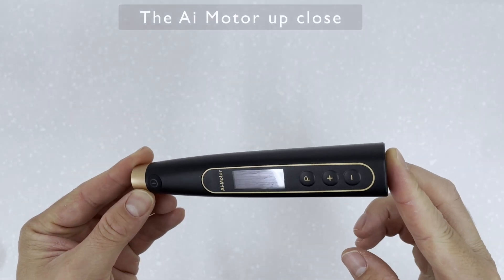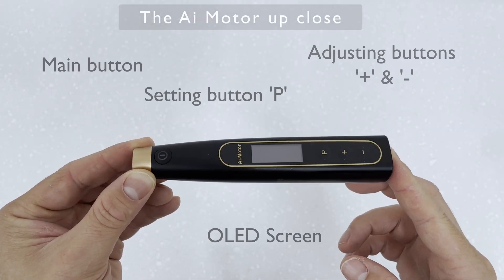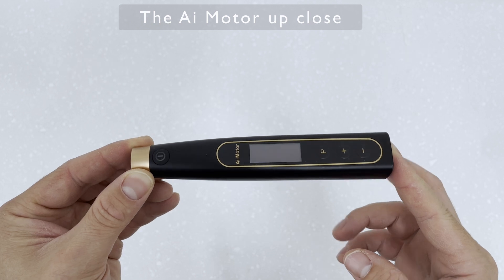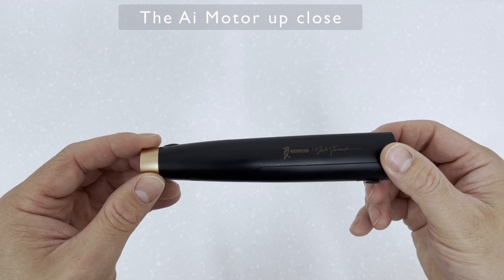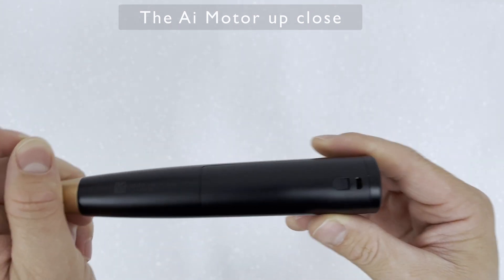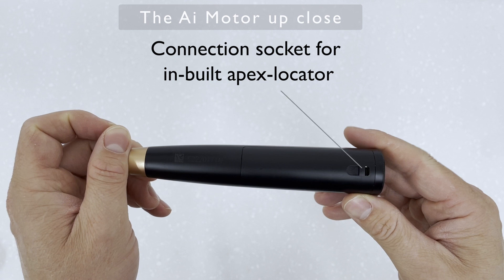The motor itself has a few buttons — very simple. It has a main button, an adjusting button where you go plus or minus, a settings button, and an OLED screen. In the rear of the unit there is a socket to plug in the Apex Locator.